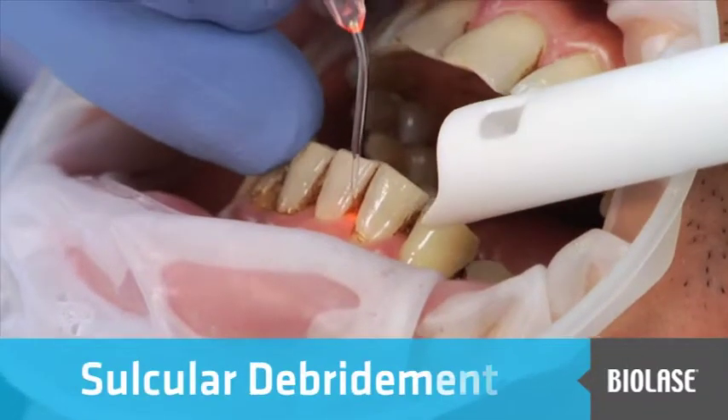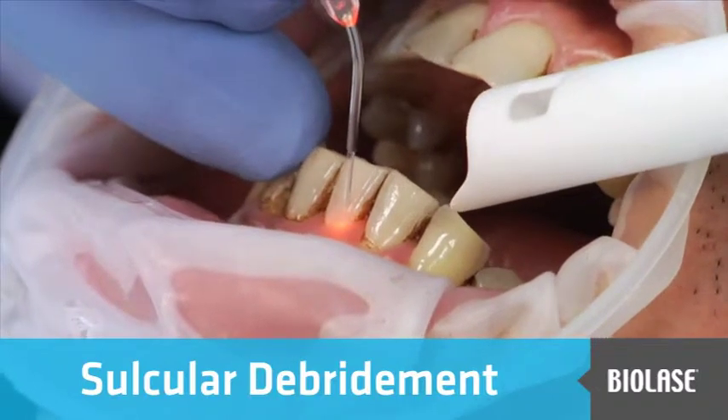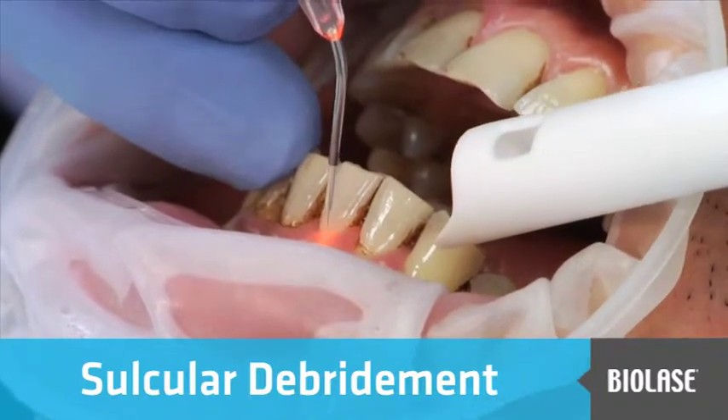Sulcular debridement is performed with the laser in the periodontal pocket setting. The most important technique tip in this case is to use a J-shaped motion.